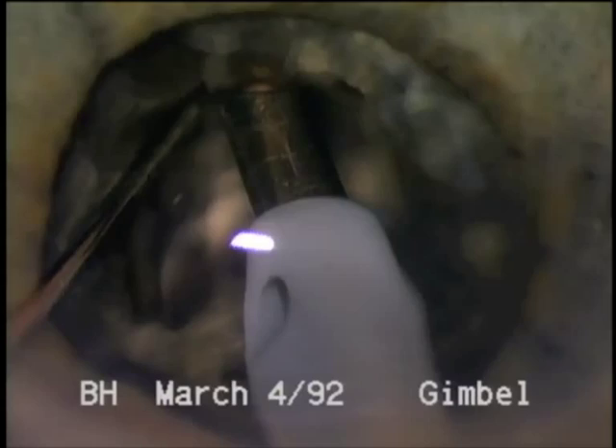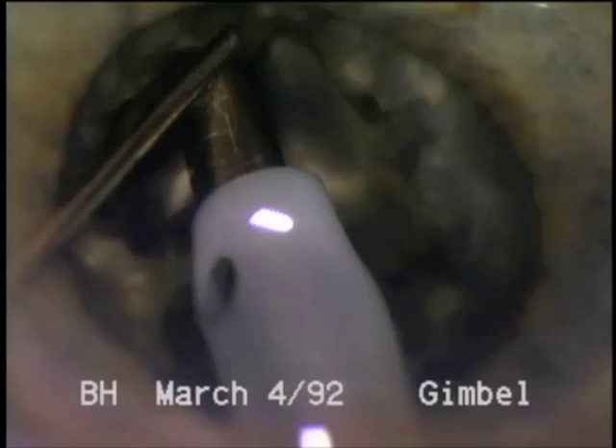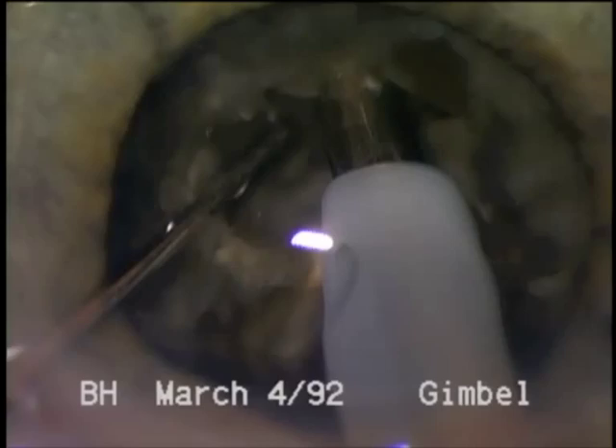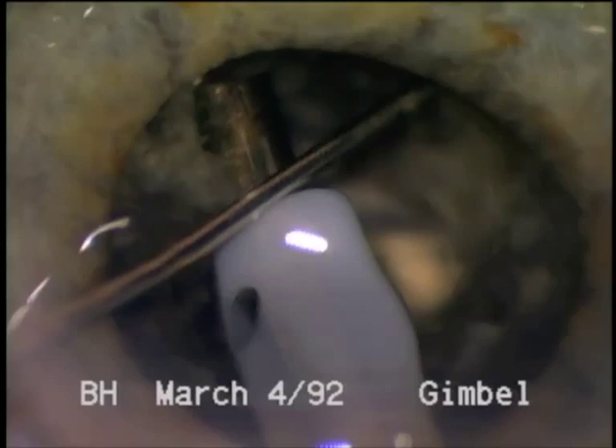A 30-degree tip is used, which has less chance of going through the nuclear rim and puncturing the capsule. A cross-action technique of fracturing is utilized in these very dense nuclear rim cases. A little notch is created in the nuclear rim so that the spatula has something to push against.